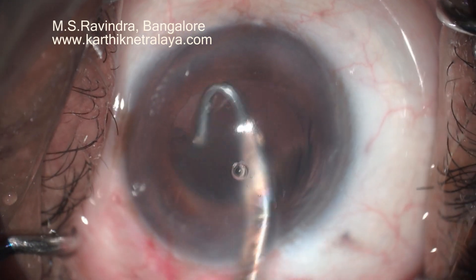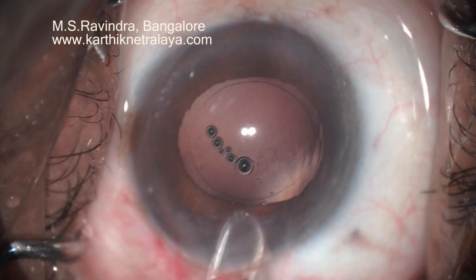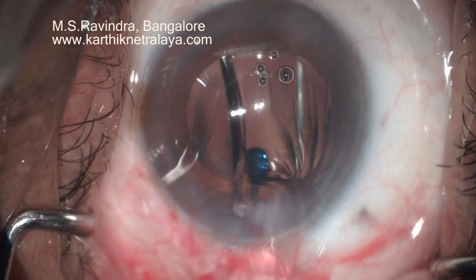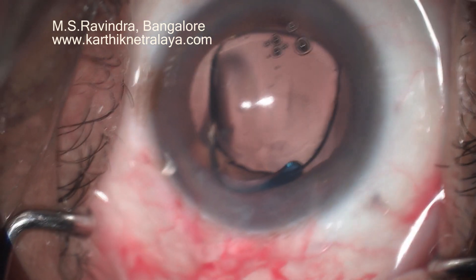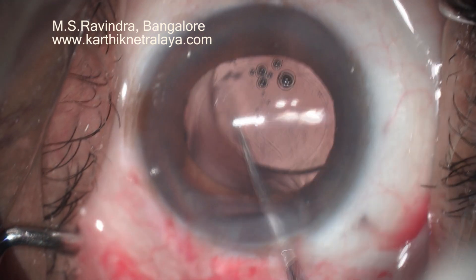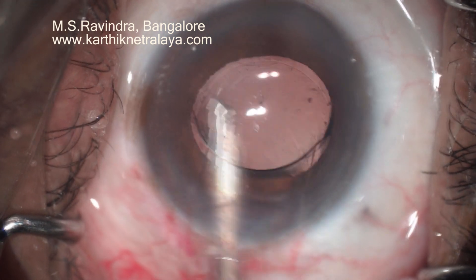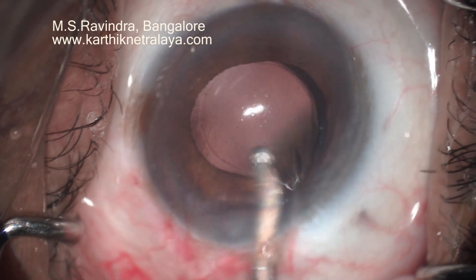These Simcoe cannulas are mounted on a silicone bulb, and with my fingertips I can control the amount of flow, which is very low. The entire surgery needs about 15 to 20 millilitres of BSS, and the vacuum created by a 5 millilitre syringe in the left hand is unparalleled with any other technique. The minute variations in pressure inside the anterior chamber and balancing of anterior and posterior pressures can be easily managed using controlled infusion as well as controlled aspiration.